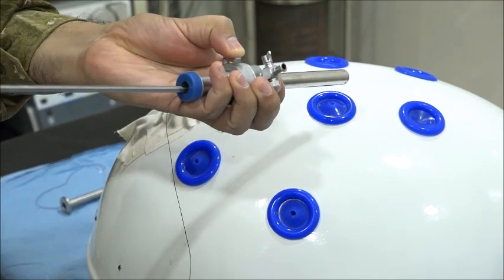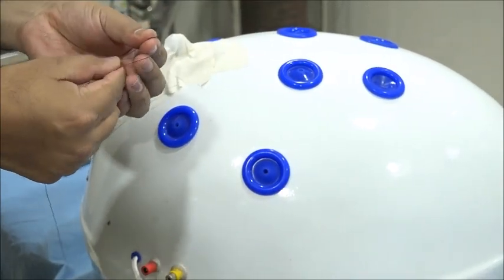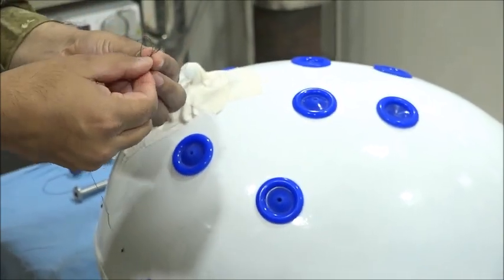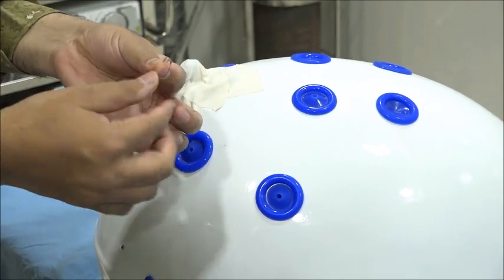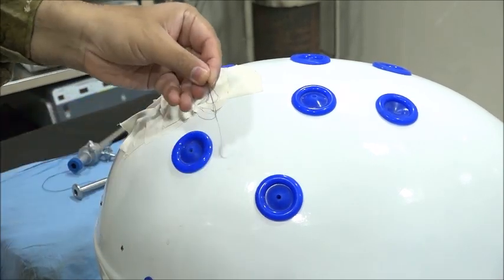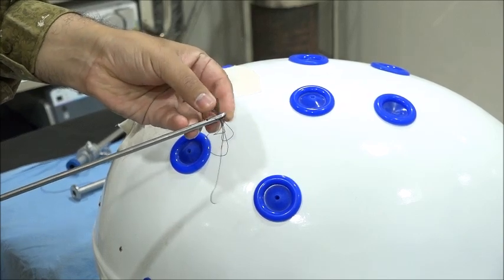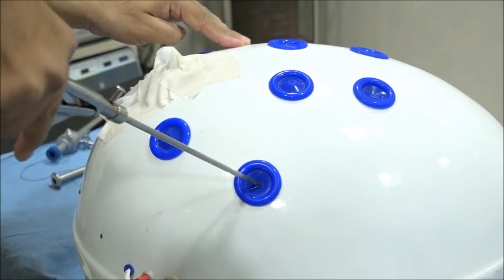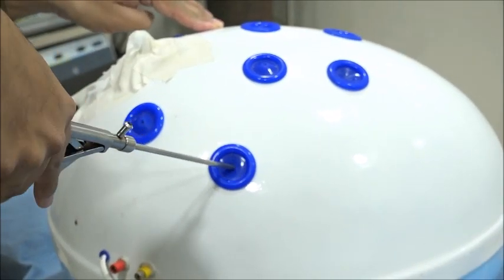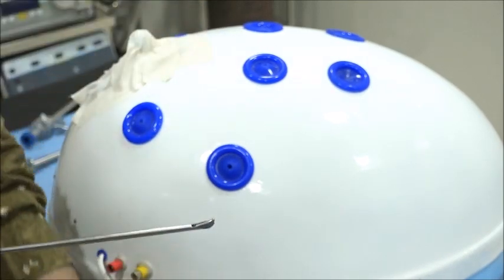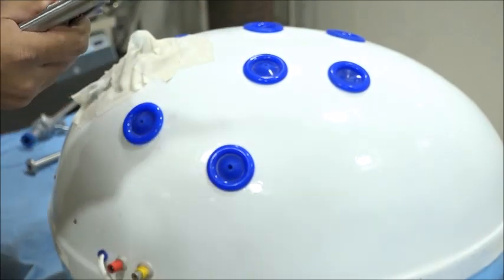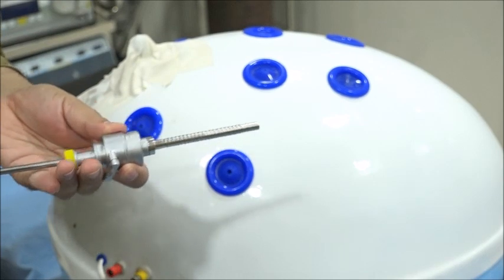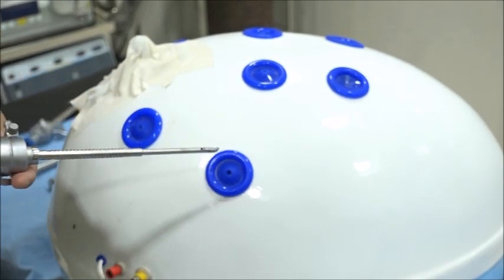If you are not using the 10 mm trocar, then with the 5 mm trocar, remove the trocar first. Generally we remove the secondary trocar in TLH—that is 2 centimeters above and medial to the left ASIS. We remove the trocar, mount it over the needle holder, coil the thread, load the thread over the needle holder, insert it in the abdomen, and then insert the trocar. That is very comfortable. Drop the needle inside the abdomen. See, the trocar is inserted later on—very comfortable for this technique.